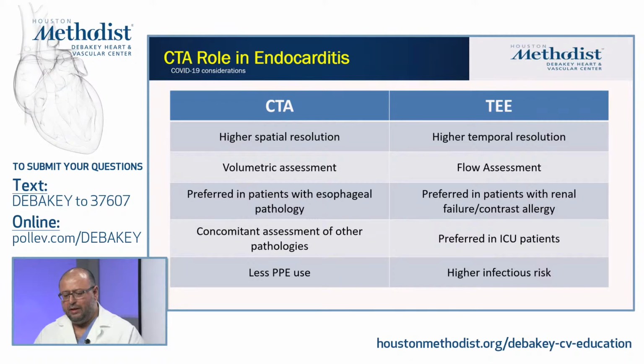The main advantage we have is higher spatial resolution, so it does allow us to look at the extracardiac structures and the immediately adjacent structures. It will give you a full volumetric assessment for these patients, and sometimes it's preferred in patients with esophageal pathology, and we can also look at concomitant pathologies in these patients. You need less PPE because you're not as often adjacent to the patient.